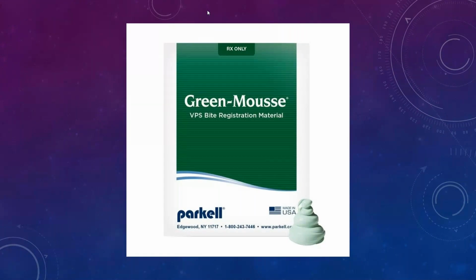Okay, if the denture that your patient shows up with is not well fitting, let's say he or she likes the bite, the aesthetics are great, but the denture kind of flops around a little bit. Make sure you use some kind of radiopaque reline material when you do the CT scan, so you can see good adaptation to the tissue and its relation to the bone, because otherwise it's not going to be precise, and you can run into some issues doing that, guys.